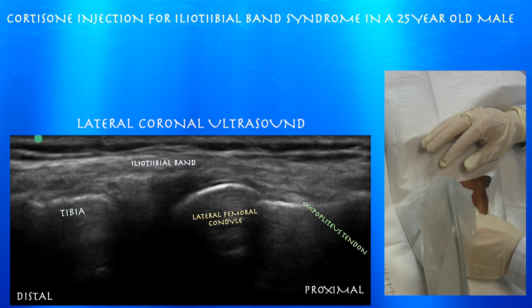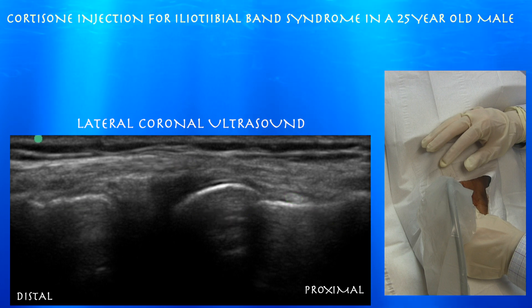Here we're looking at the joint line. You can see the iliotibial band and how it runs over that as it attaches on Gerdy's tubercle on the tibia. You can also appreciate the popliteus tendon as well.